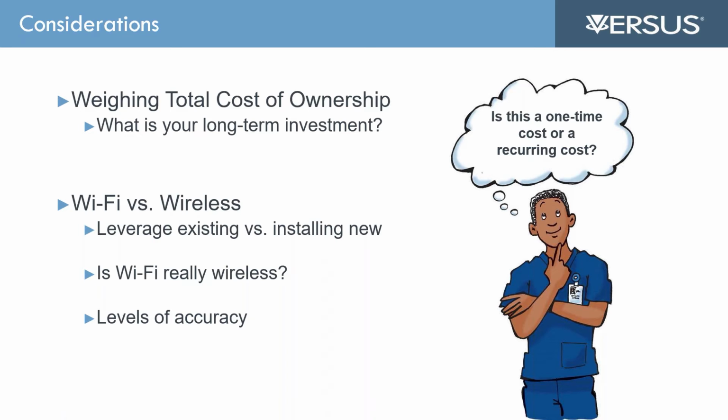It's very zonal in the way that it provides location information. Or if you are leveraging that, what other hardware might be required in order to get better, more accurate and granular location, as opposed to installing a new system, something that has maybe proprietary hardware or requires cabling, or just adding additional wireless functionality and hardware that leverage that system, but truly understanding what you're getting as far as the granularity based on your needs and management of the equipment.